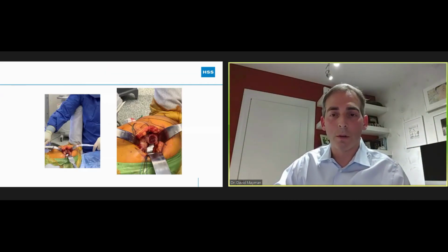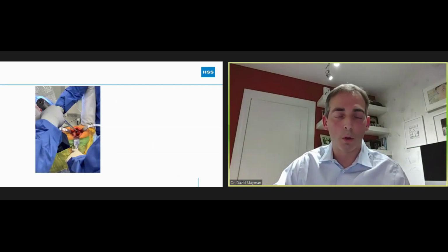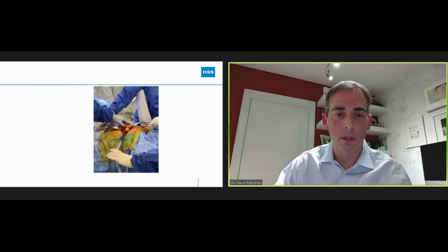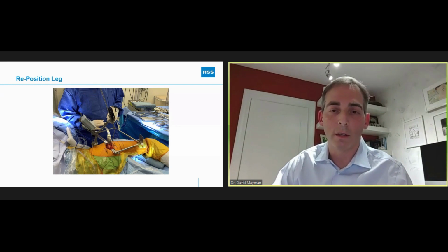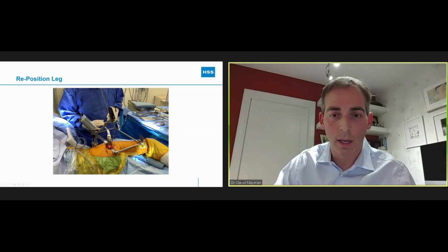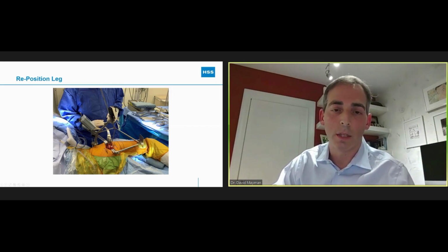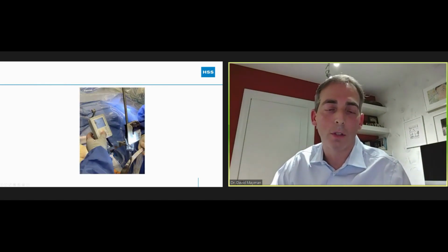So then we move on to the femur, and this is just standard femoral exposure for a posterior approach. I use a ream approach system. So this is me reaming here. This is a trial broach in place. And you can see we're about to do a trial reduction here. And then once you do that trial reduction, you reposition the leg. So the laser that's on here, again, you position the leg so that it's pointing at that point, that crosshair that you've marked on this plate down here. You put the probe back in that checkpoint. You push a button on the device, and it tells you where you are compared to where you started.